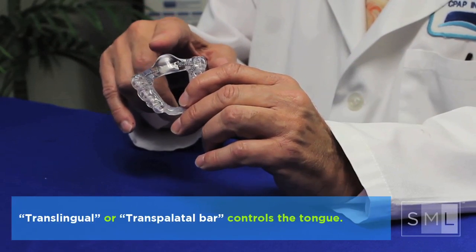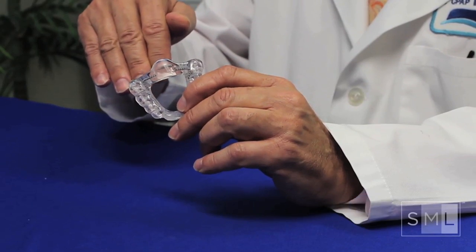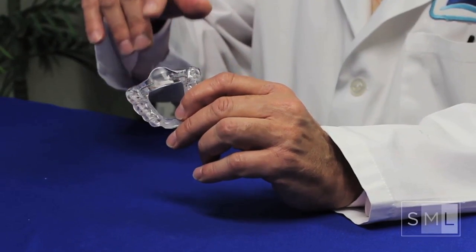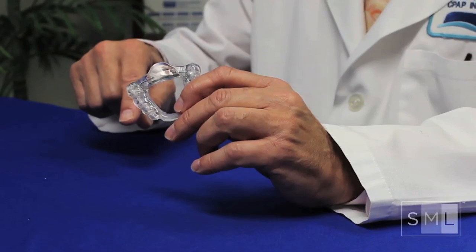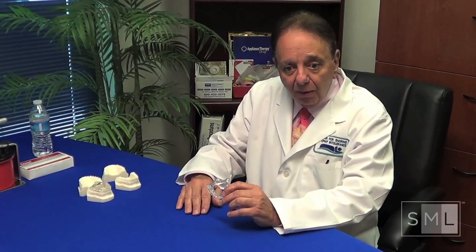We use the translingual or transpalatal bar to control and inhibit the tongue. Then we put a little tail that we expand and push down — very similar to the MD's tongue blade that pushes the tongue down so he can see the airway. We're going to keep the airway open with this.